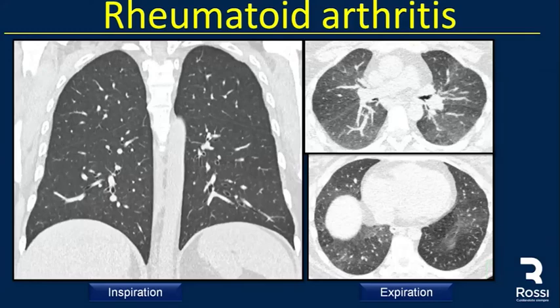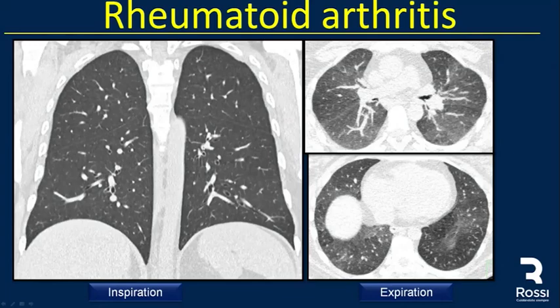We always perform expiratory CT in patients with rheumatoid arthritis and Sjogren's, as both entities can manifest with bronchial disease and constrictive bronchiolitis. In this case, there is a slightly normal coronal view on inspiration. When we perform expiration, we see areas of air trapping with areas of normal lung in a patient with rheumatoid arthritis.